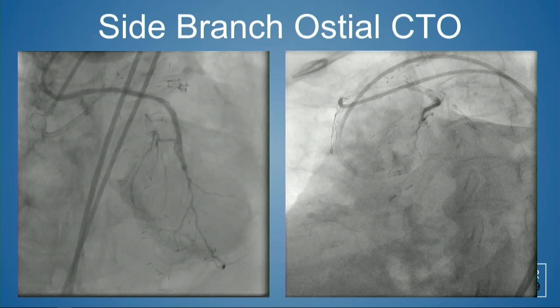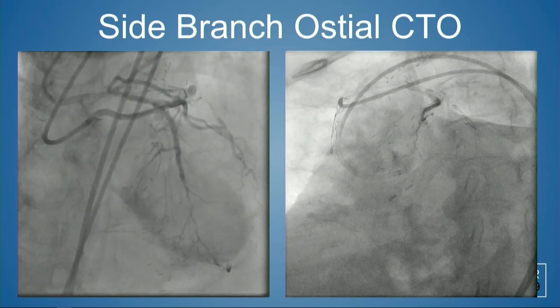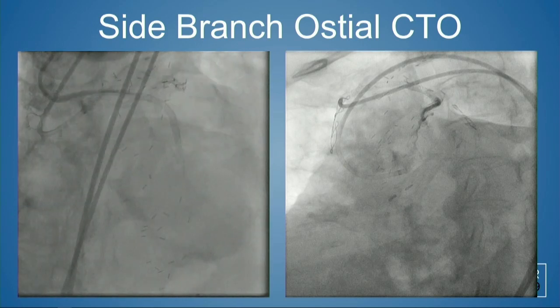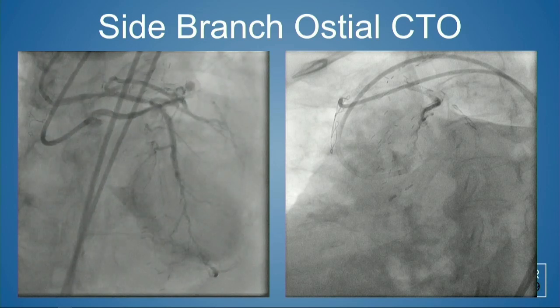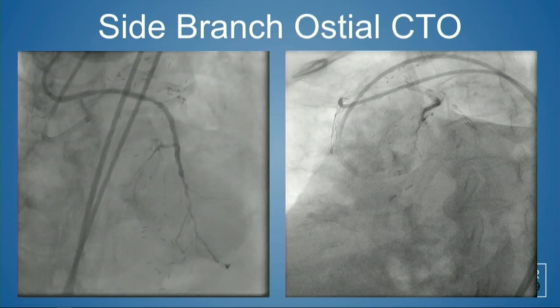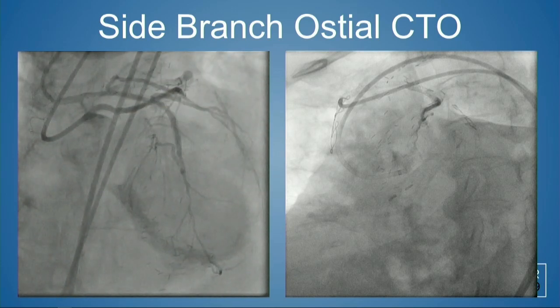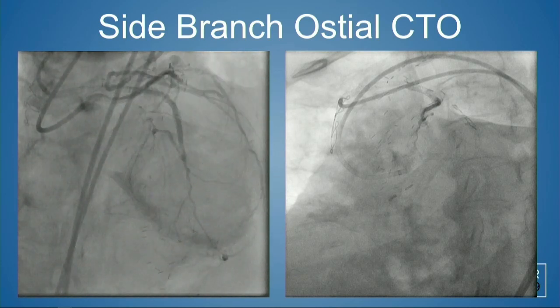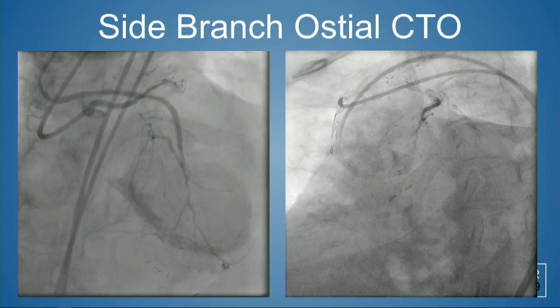This next case is a gentleman I took care of a couple times over the last few years. Previous bypass surgery, had a vein graft to the circ system and had a vein graft to the LAD. And he had multiple vein graft failures over the last 10 years or so. A couple years ago, I fixed his left main into his circumflex because of multiple vein graft failures. And he came in again with another vein graft failure to the LAD. And so we were going to fix this.